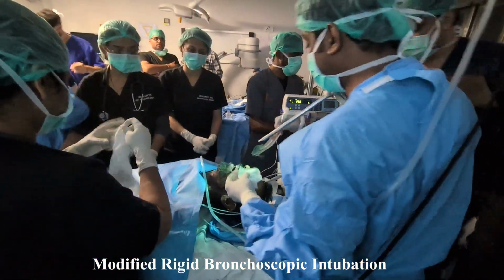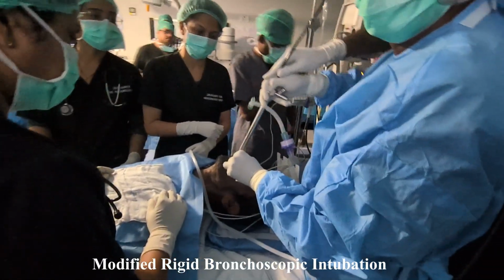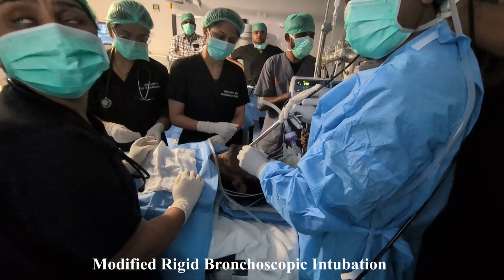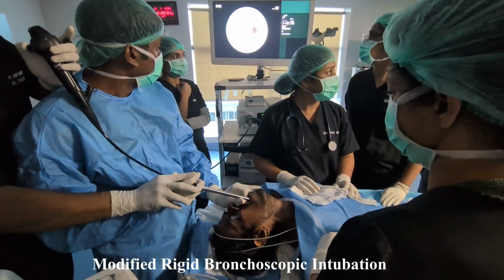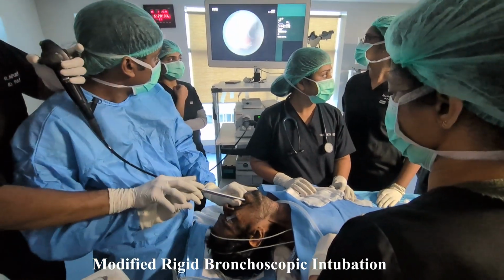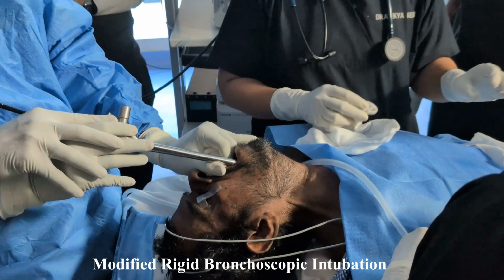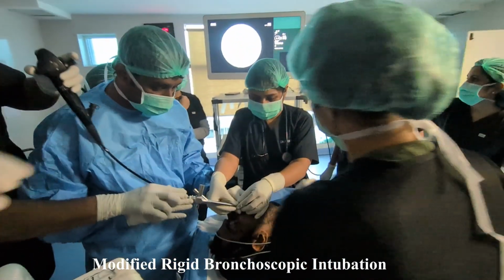As you can see from the video here, I am intubating this patient with the help of a rigid bronchoscope, using the flexible bronchoscope as a light source as well as a suction channel. This eases the performance of a rigid bronchoscopic intubation, and it provides a clear vision during the rigid bronchoscopic intubation, and this is something which we do routinely in our setup.